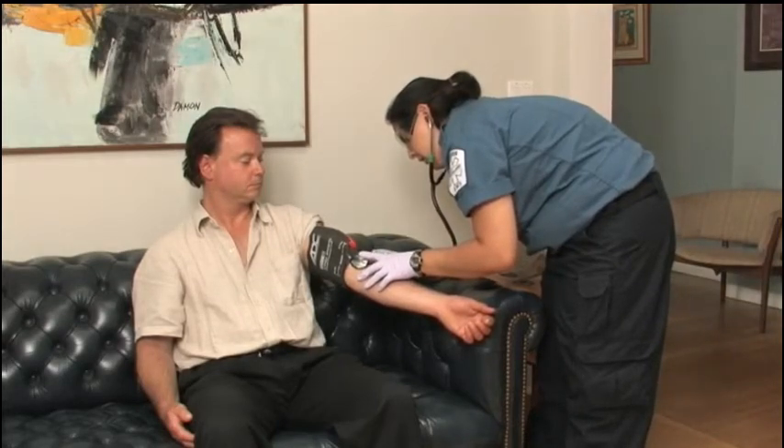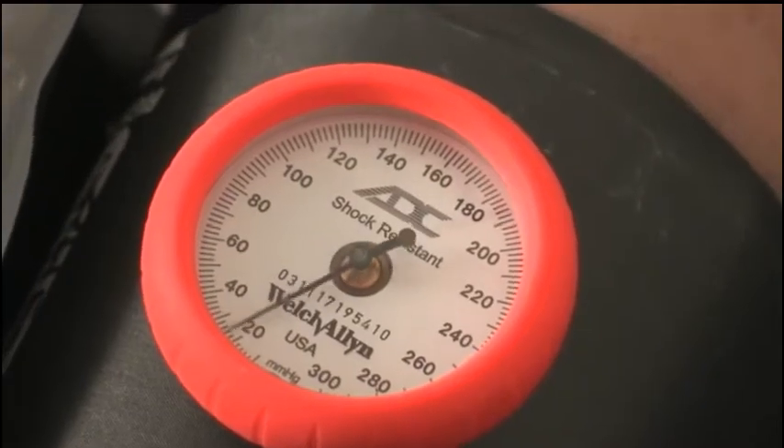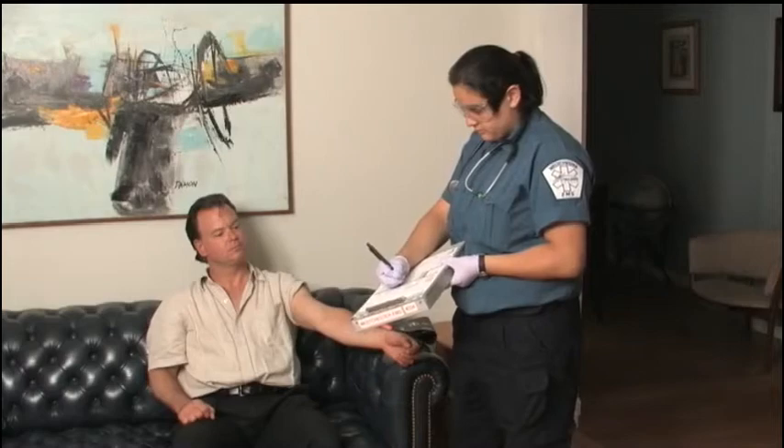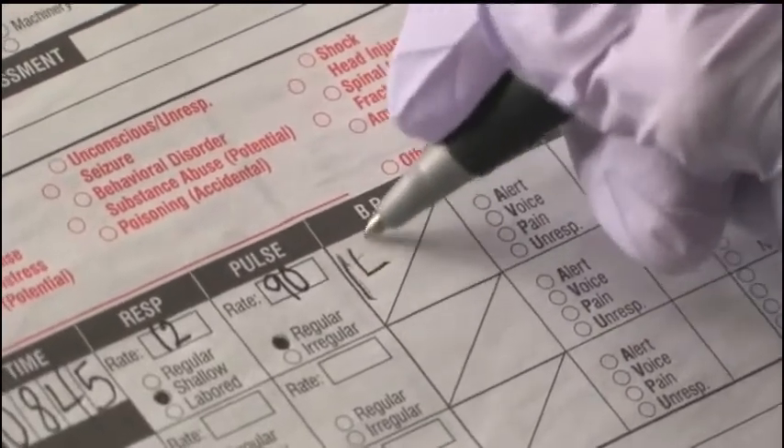Since you now have both your diastolic and systolic measurements, let the cuff deflate rapidly. Record the measurements and the time. Blood pressure is recorded in even numbers.